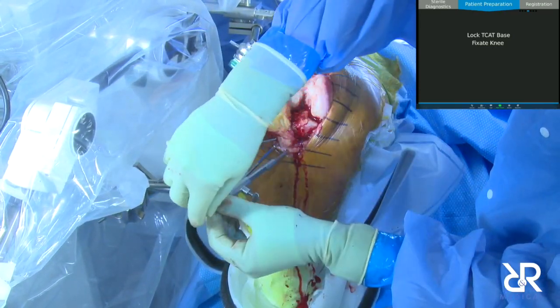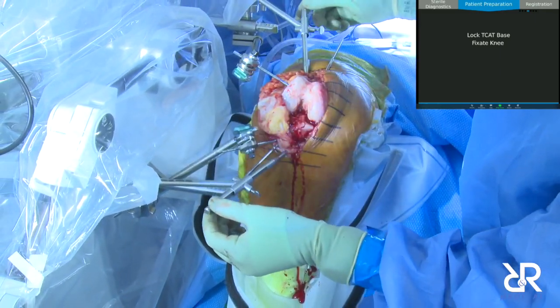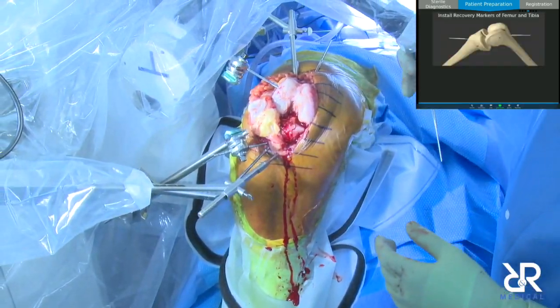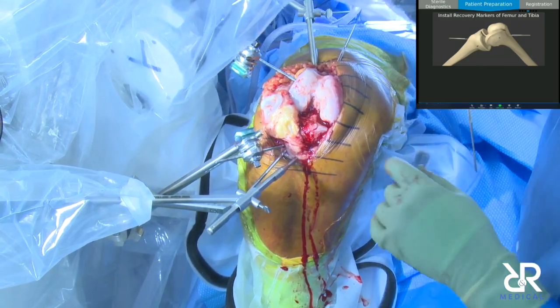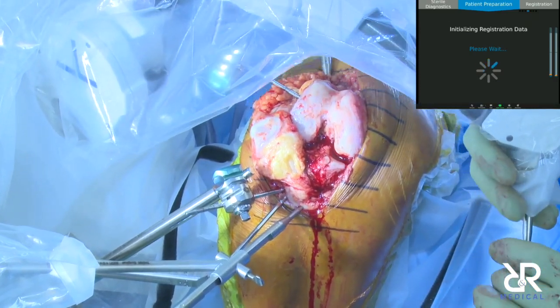Yeah, it's two pins in the tibia, two pins in the femur, just like Mako. All right. Can I see this? It actually works if you sublux it a little bit, but it's not always possible.